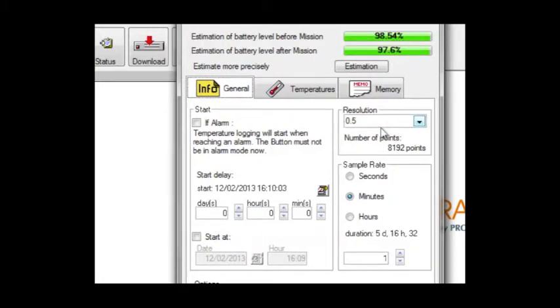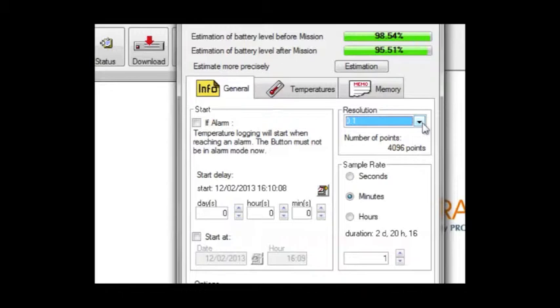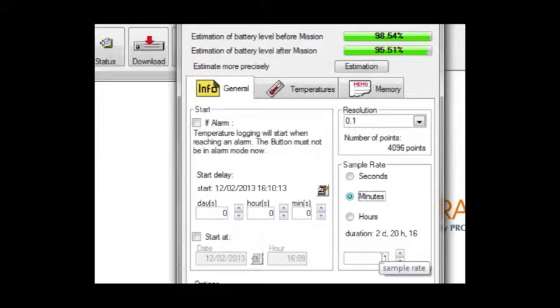This thermobutton is a 22L, you can therefore choose the resolution. Select the sample rate. The duration of the memory will be adjusted accordingly.